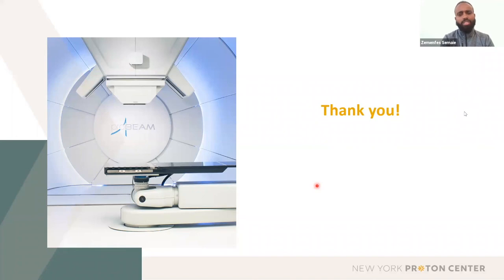I would say rotations, we haven't treated any patients with couch rotations here. I remember at Maryland Proton Treatment Center, we had one patient, I believe. But as far as couch rotations, it can't be very many, just because the SDX apparatus on a patient has a cord that goes into the SDX trolley. So you're able to move the SDX with it, but you're less likely to have those types of patients. It's doable, but you just have to be very creative.